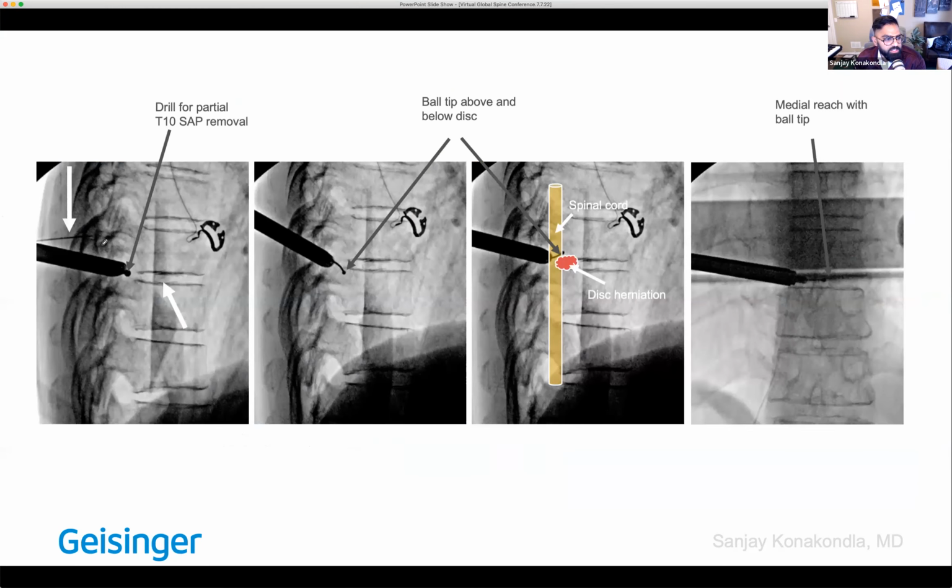So, these are some key pictures. Note this spinal needle here. I put a spinal needle to have at least one static instrument to denote the level once we're done counting, because that's the only instrument that's not moving throughout the case. So I like to have that as a home base to remind ourselves that we're at that disc level that we need to be at.